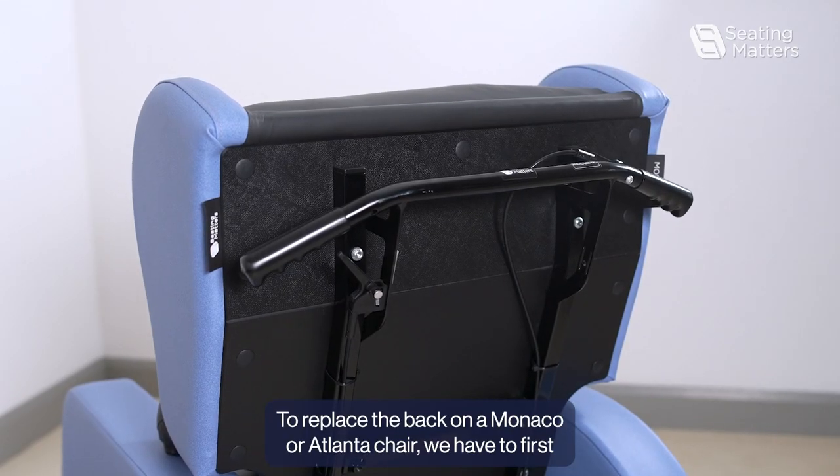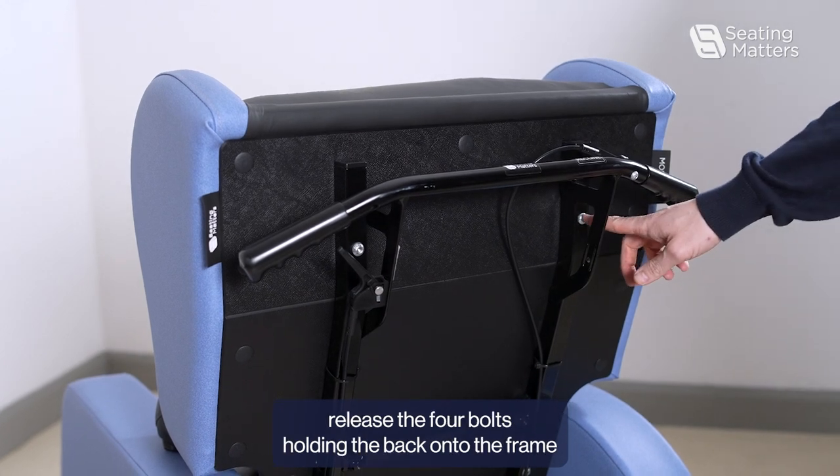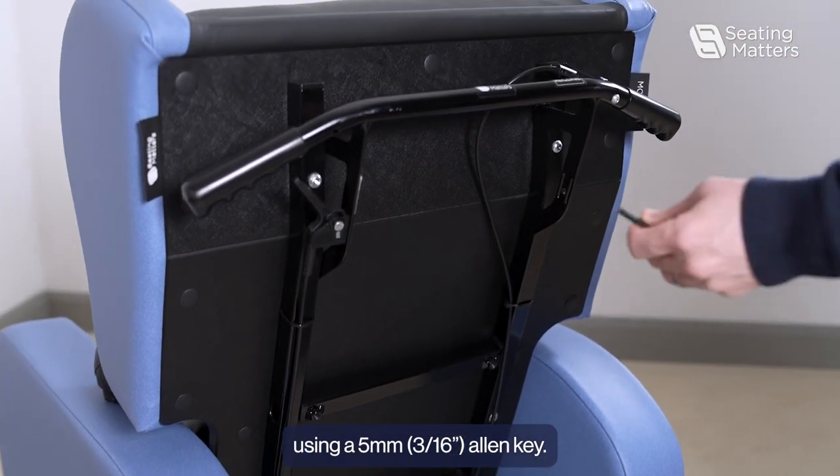To replace the back on a Monaco or Atlanta chair, we have to first release the four bolts holding the back onto the frame using a 5mm Allen key.